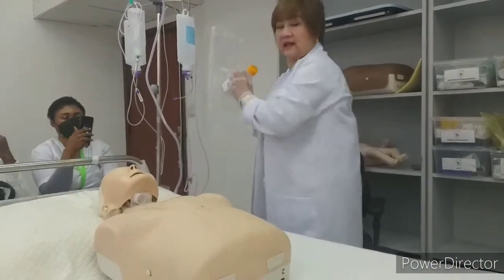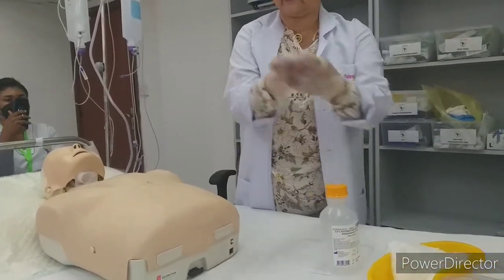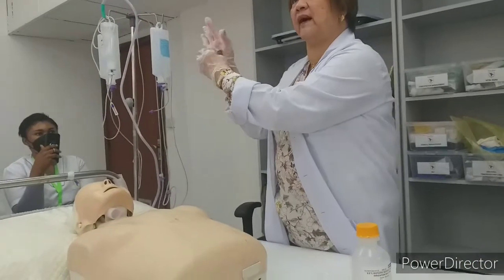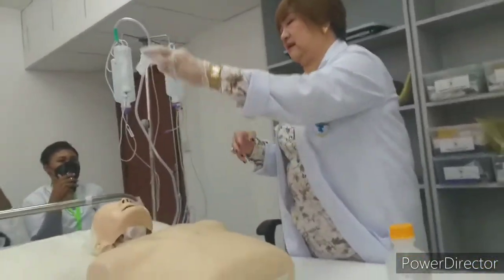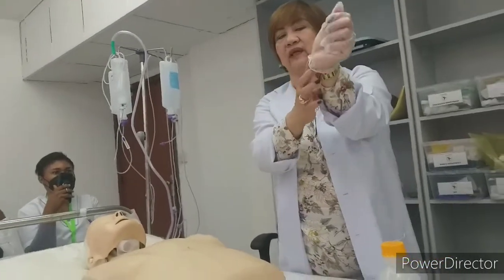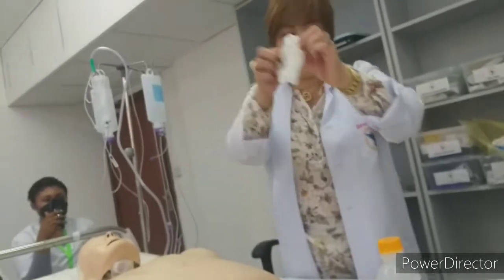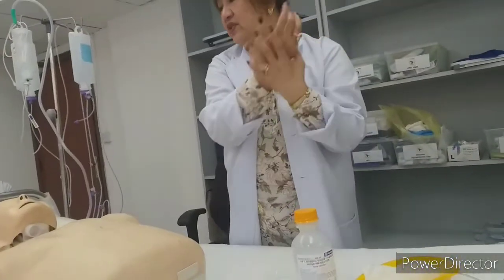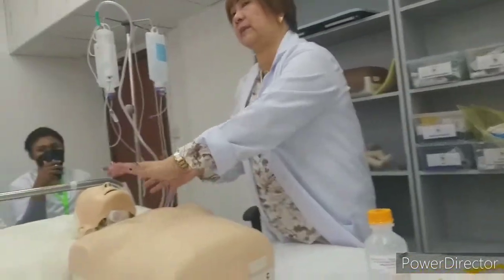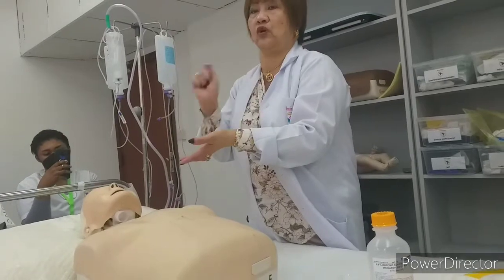Okay? Then take off your glove. Taking off the glove from the middle, out. Clasp it with the 2 fingers, roll it out, and to the medical waste. Okay, now, hand washing, hand hygiene, go back to the patient. Keep the patient comfortable and document.